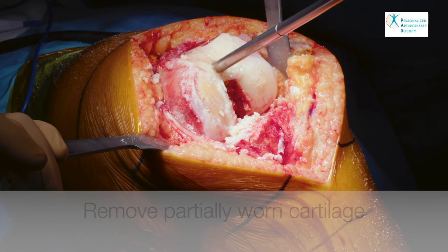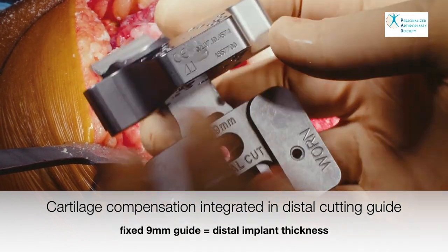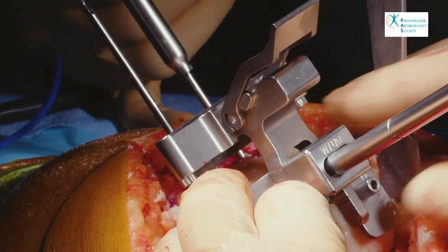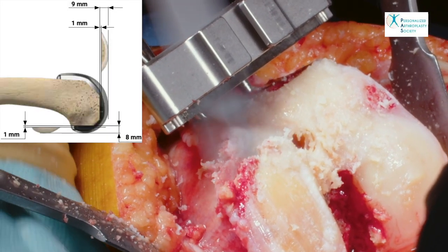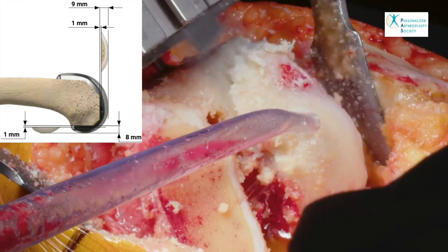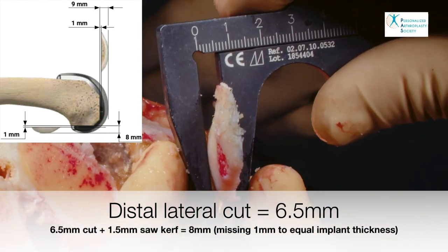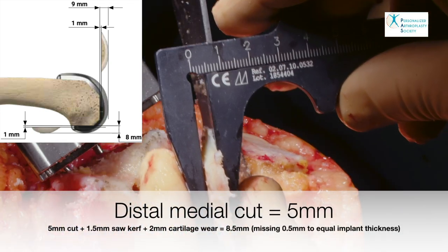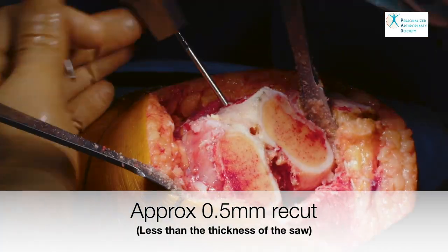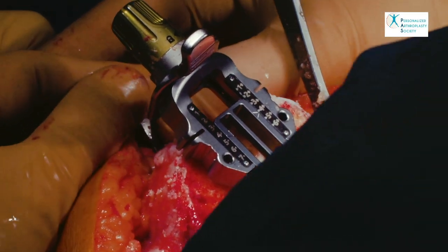Partially worn cartilage is completely removed and a 2 mm compensation integrated into the distal femoral cutting guide is used for the affected condyle. Rotation of the distal cutting guide is set parallel to the posterior condyles and is fixed in place. The essence of the kinematic alignment technique is to effectively resurface the knee — that is to remove the same amount of material as we are implanting. Distal condyles are 9 mm thick and posterior condyles are 8 mm thick. Every cut is thus measured and verified with a caliper to confirm the resected thickness. Posterior condyle cartilage wear compensation can be used if required to reproduce pre-arthritic rotation.